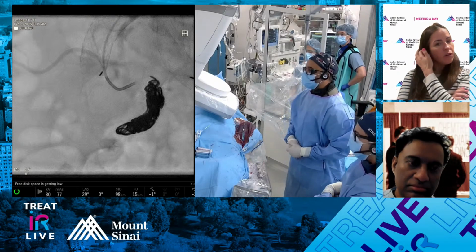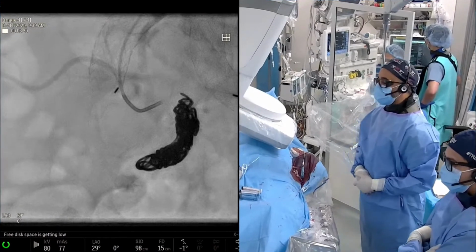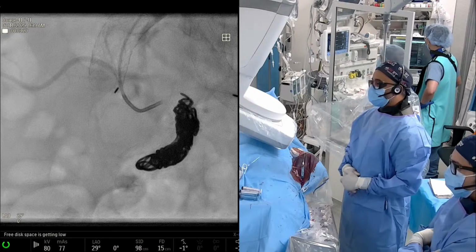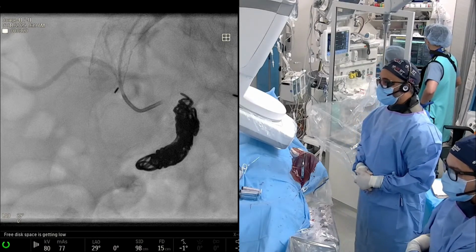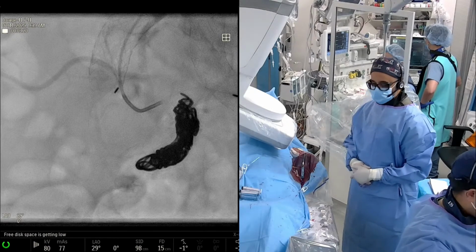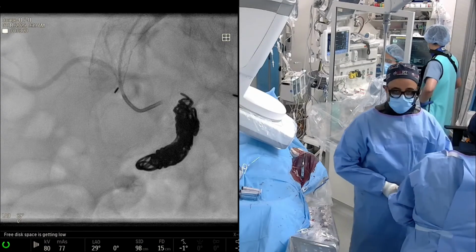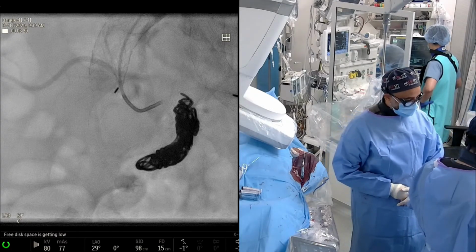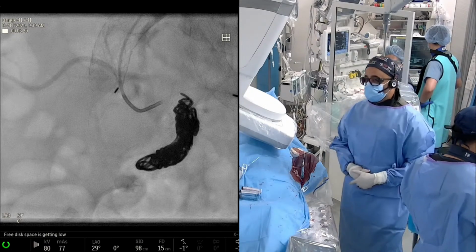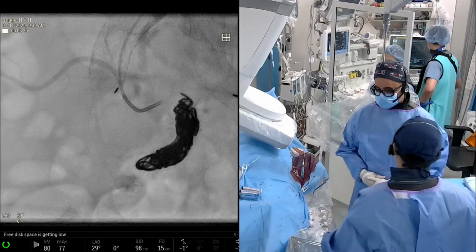Rahul, any thoughts? Yeah, I kind of like that idea of just trapping it and then you can do whatever you want. You can also switch to liquid here if you wanted to. It's a little tricky, although hopefully it'll all get stuck in the coil pack. Usually we tend not to do that. Maybe on aneurysms we'll sometimes do that just because you get kind of bored shoving coils until the cows come home. You know, switch to either thick glue. We haven't really done Obsidio. Honestly, even with this, you're probably going to be fine, right?